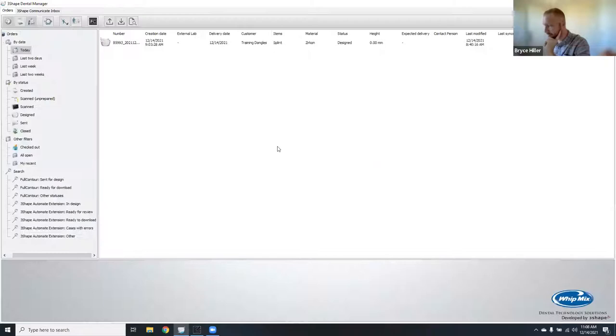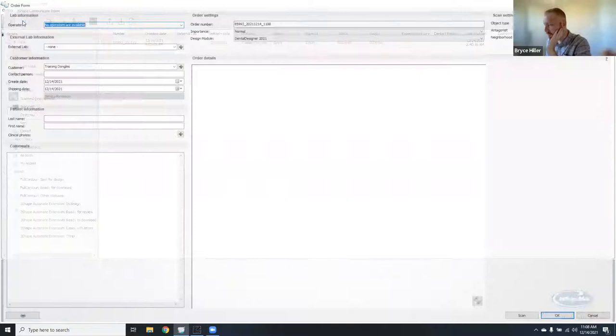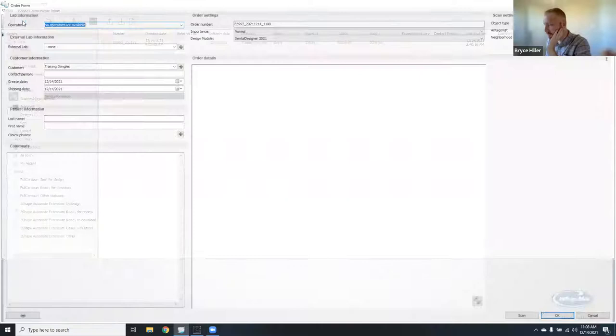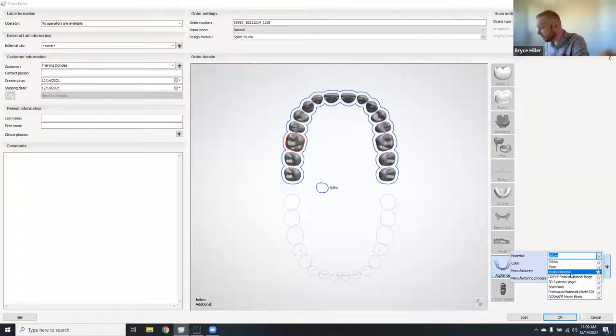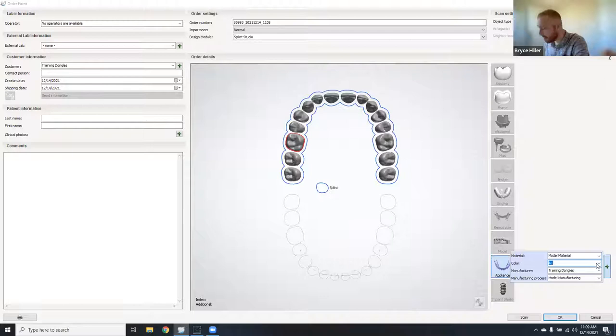To order a splint, start a new order and fill out all your normal patient information. Select any tooth on the maxillary arch and select 'Appliance' at the bottom — the first default option is 'Splint.' Hovering over the green plus symbol lets you specify your material. We'll choose model material. You can choose a shade if you want, though it's not super relevant here. Then adjust the object type: if scanning it in, leave it on 'Model'; since we're importing intraoral scans, choose 'Digital Impression.' Click OK.